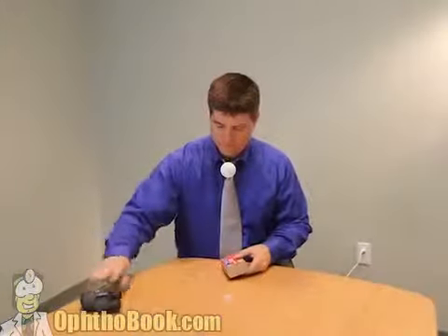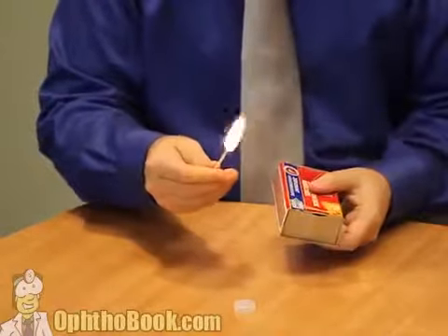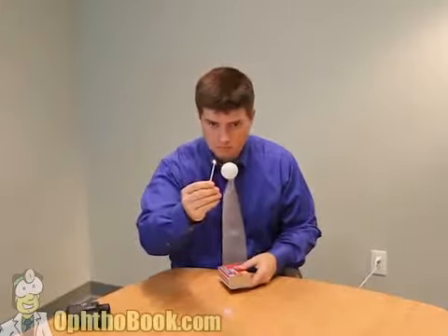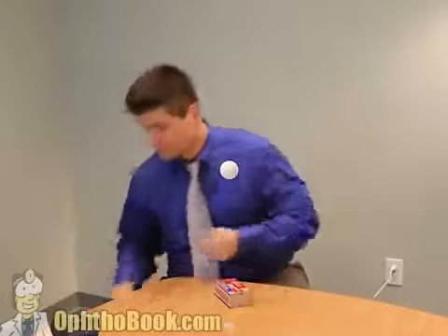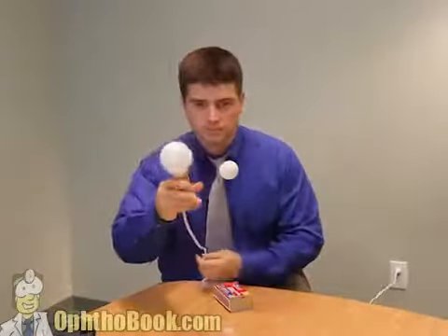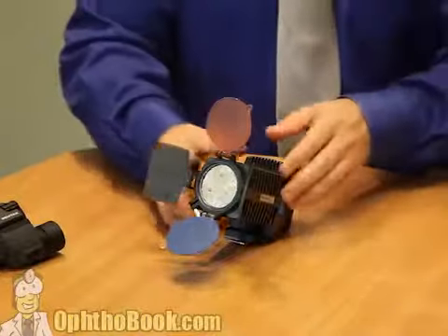So far, so good. Now we need a light source. Early microscopes used the sunlight or even flame, a candle, to look at the eye, but it's just not enough light, and as we know, the eye is sensitive to flame. So with the invention of electricity and the light bulb, we improve our design and start using a light bulb to see what we're doing. But once again, not ideal.